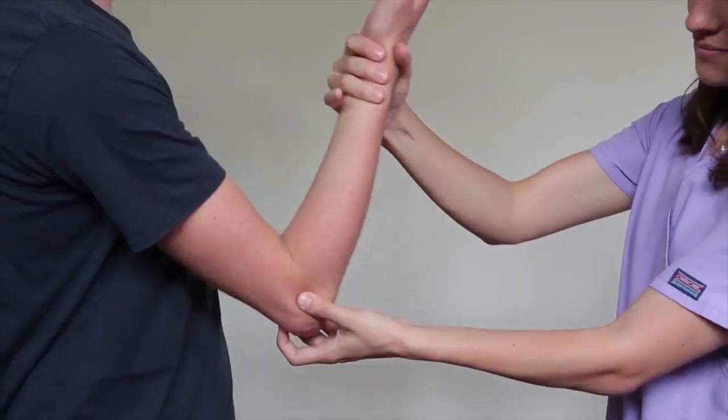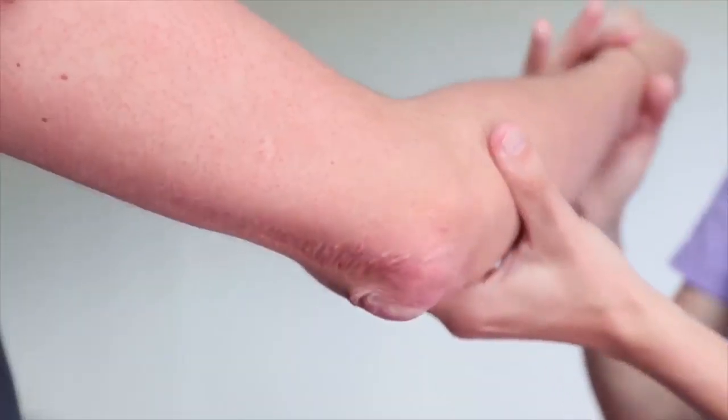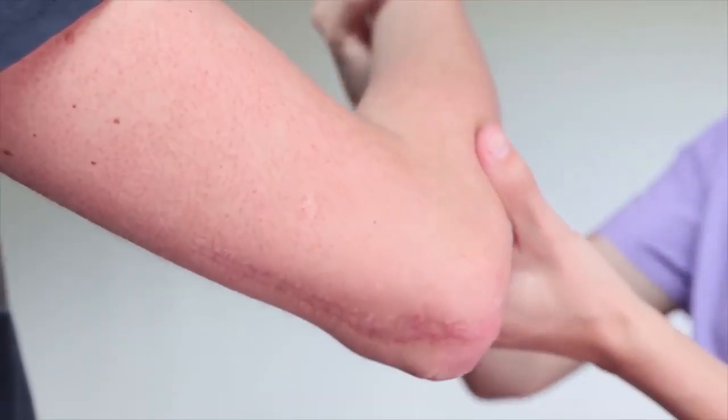Elbow contracture caused by traumatic injury is a major cause of disability, especially among children and the elderly.